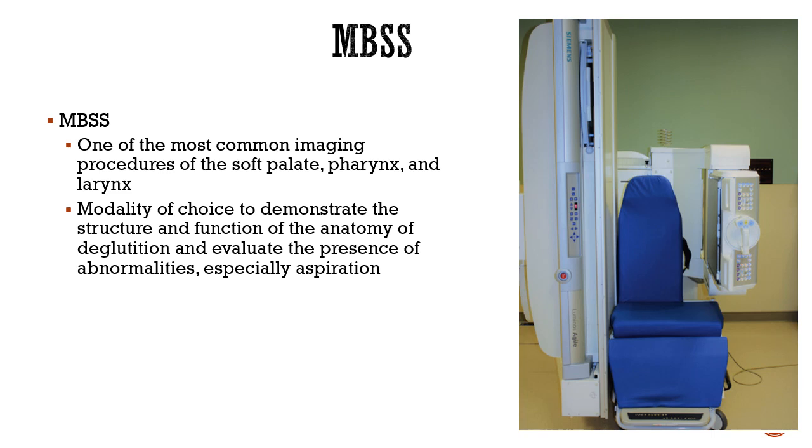The modified barium swallow is one of the most common imaging procedures for the soft palate, the pharynx, and the larynx. It's a modality of choice to demonstrate the structure and function of the anatomy of deglutition and evaluate the presence of abnormalities, especially aspiration.